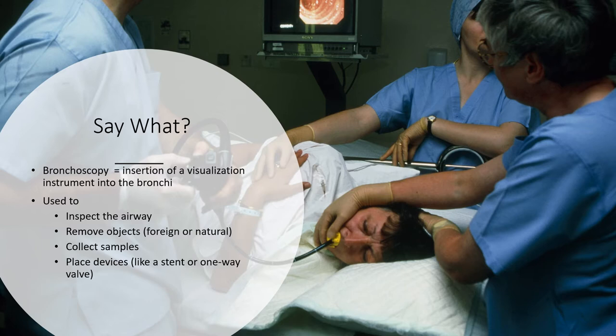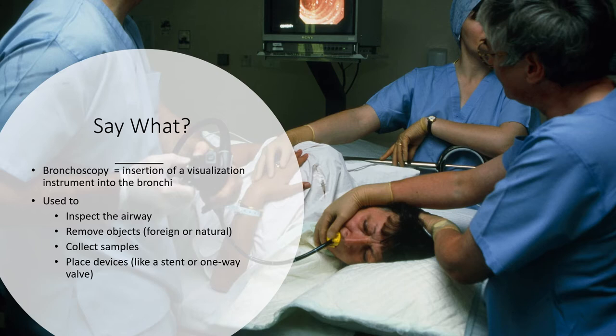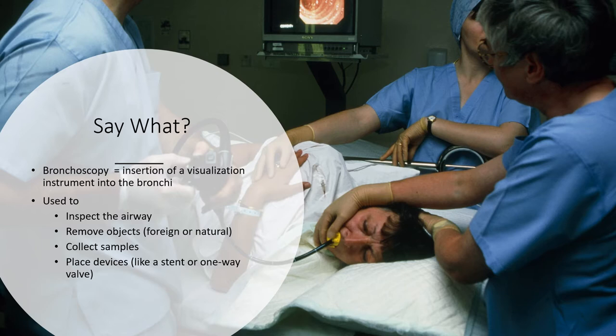We can also place devices like a stent, or a one-way stent valve used for people with emphysema. That stops those blebs or big pockets of gas, sucking out air from diseased tissue to ultimately help the lungs function better. So bronchoscopy is pretty neat overall with its flexibility.